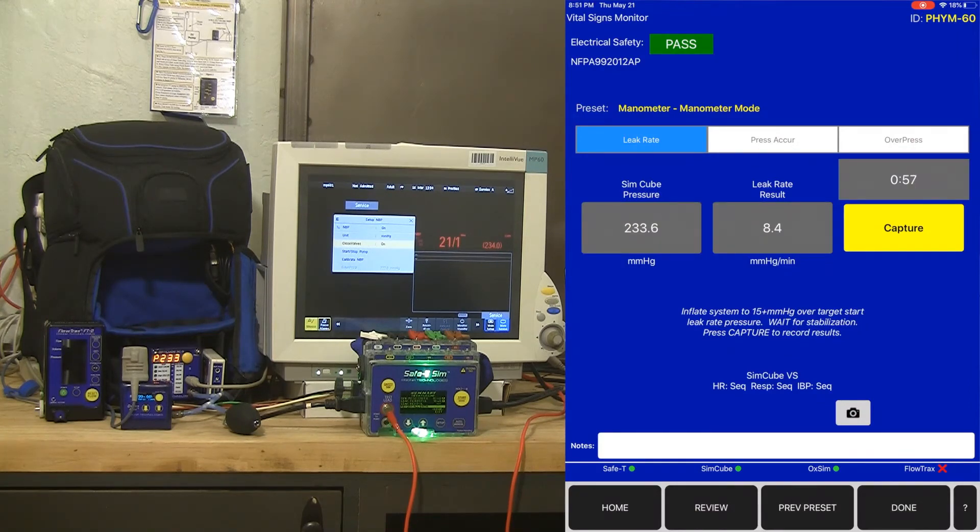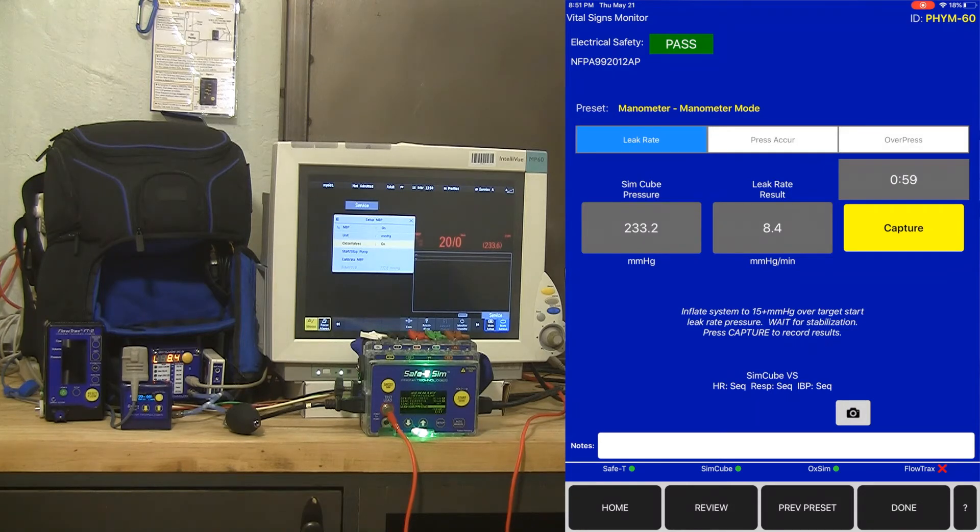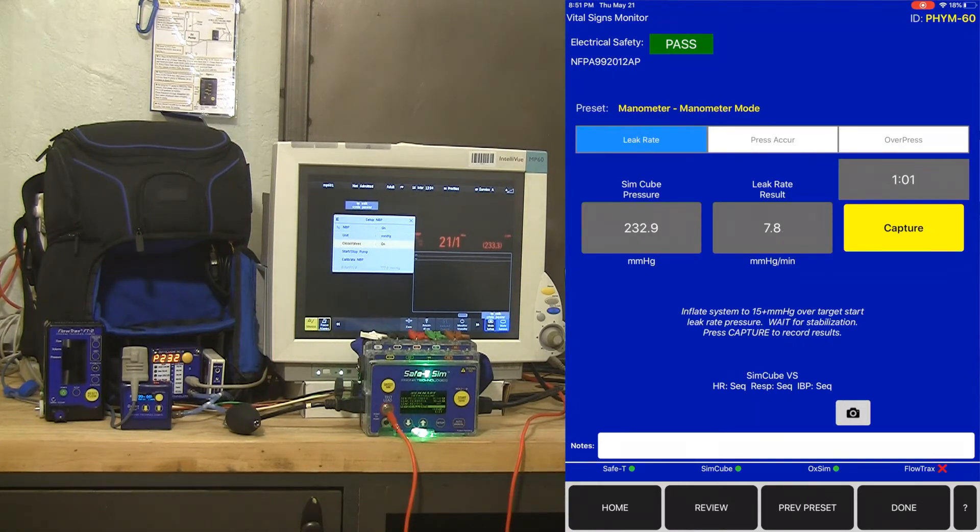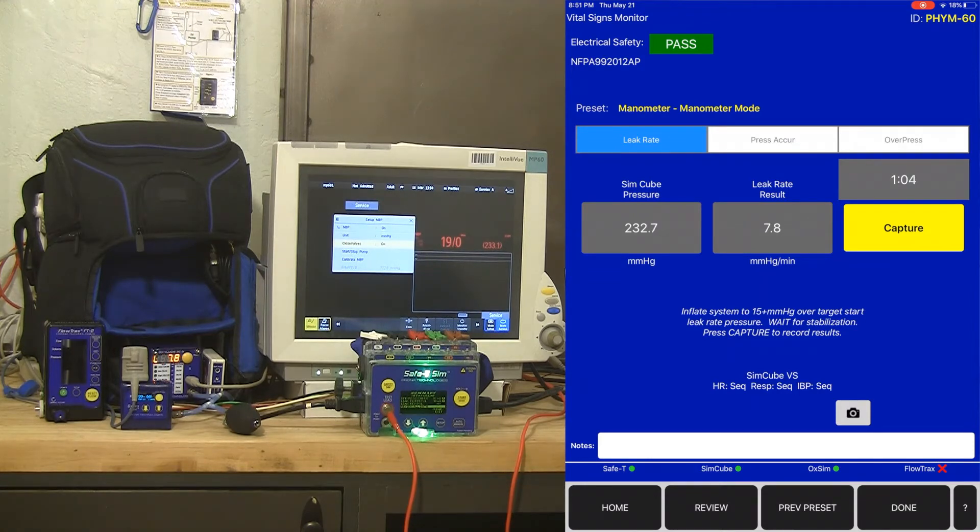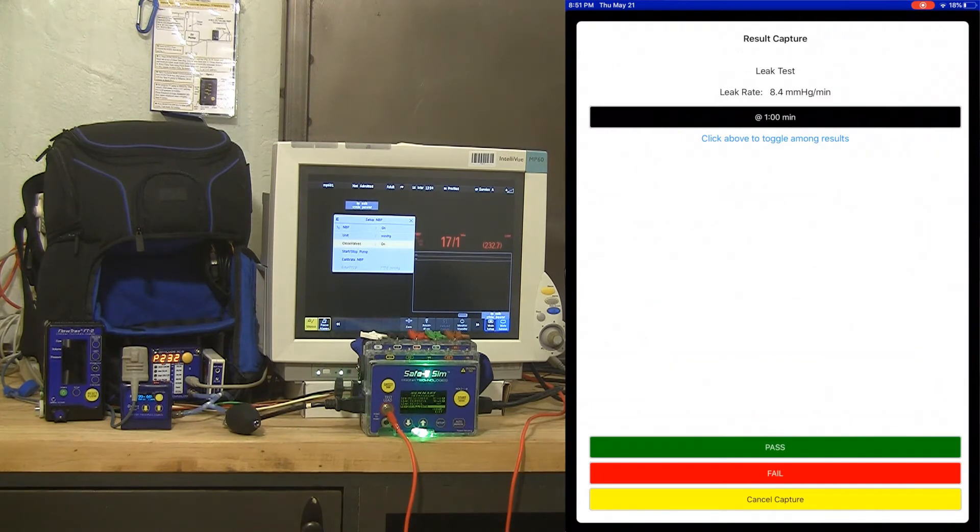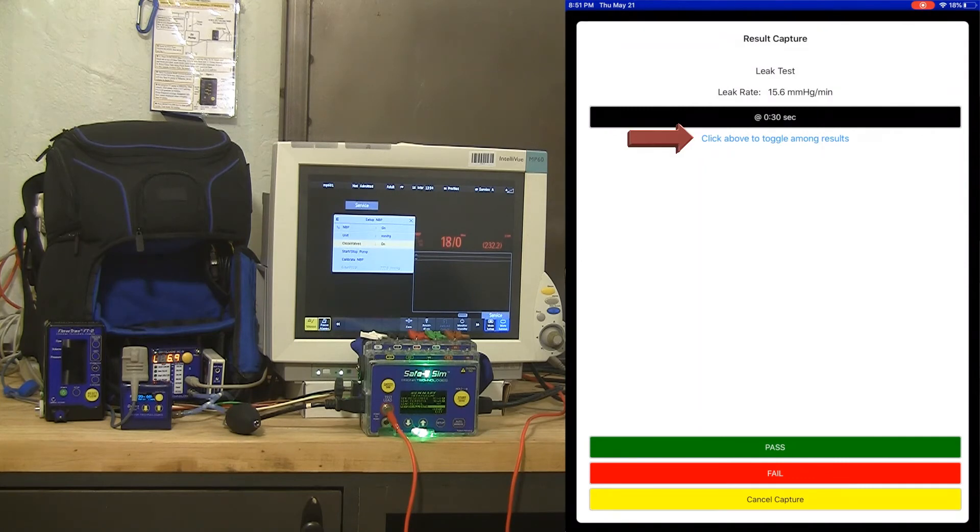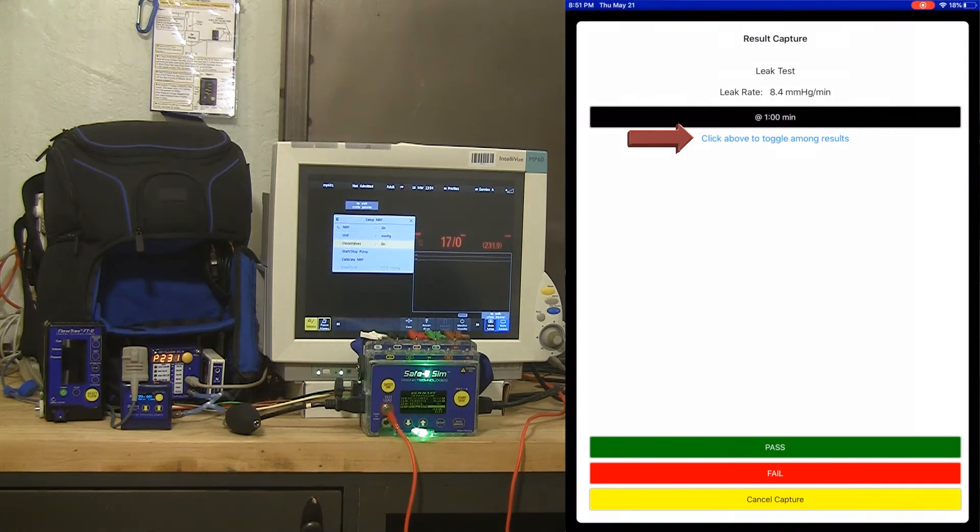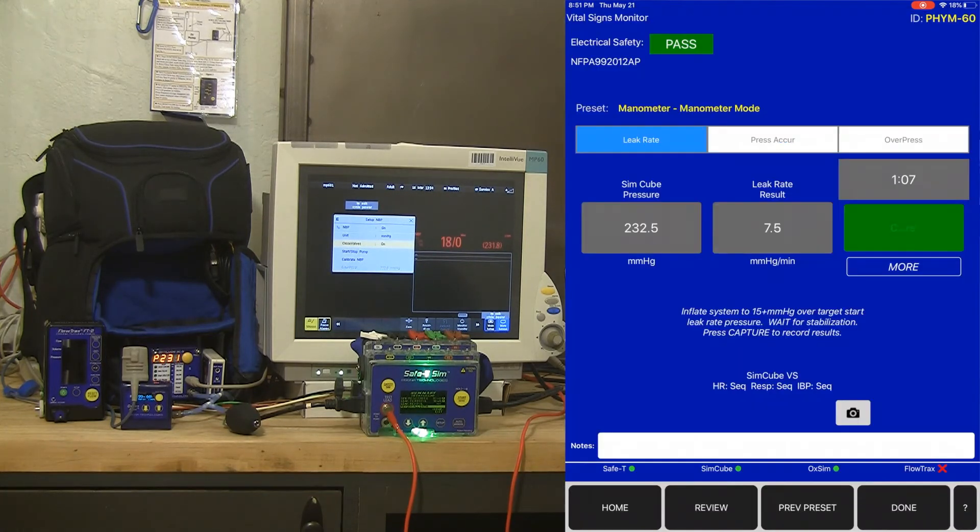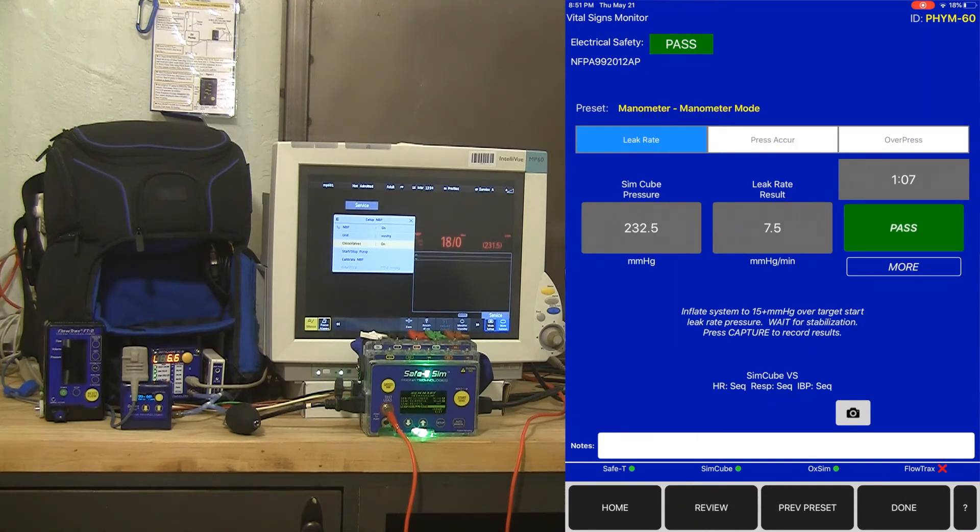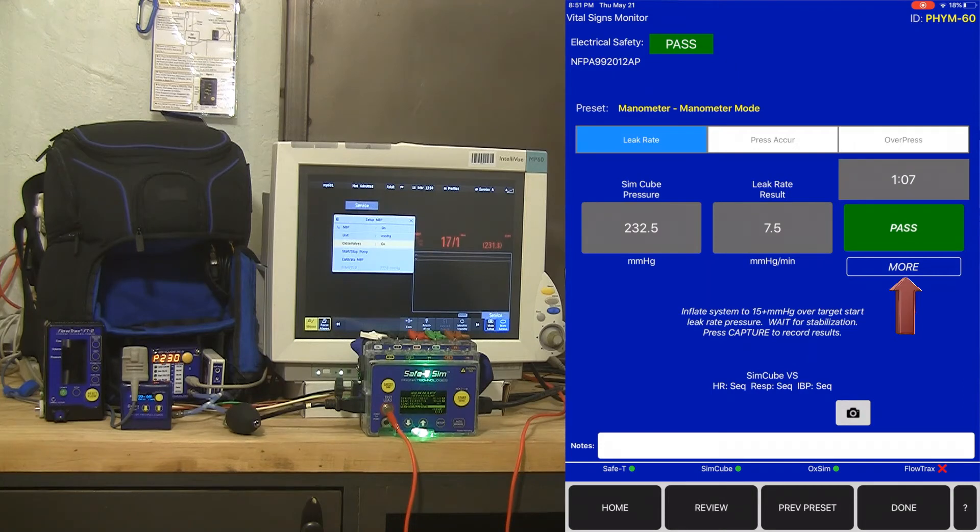So I'm going to go ahead and hit capture. You don't have to hit capture right at one minute. If it goes over one minute you can hit capture and choose 30 seconds or one minute or a minute and a half for example. We've gone over one minute. I'm going to hit capture. You can see here that we've got a leak rate of 8.4 at one minute and you can toggle that between one minute and 30 seconds. I'm going to call that a pass for the purpose of this and if I need to run a second leak rate test there's a more button directly below that pass button.